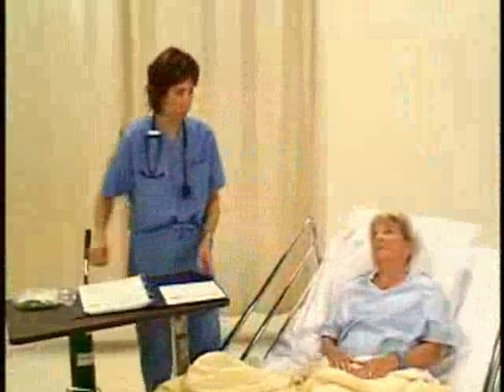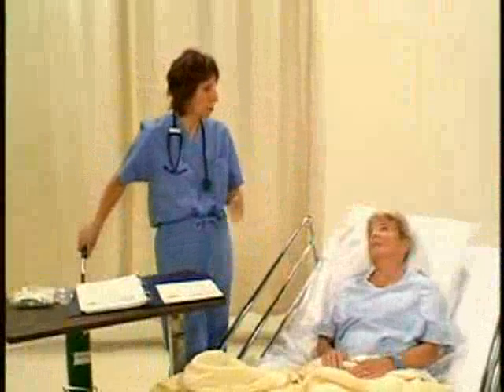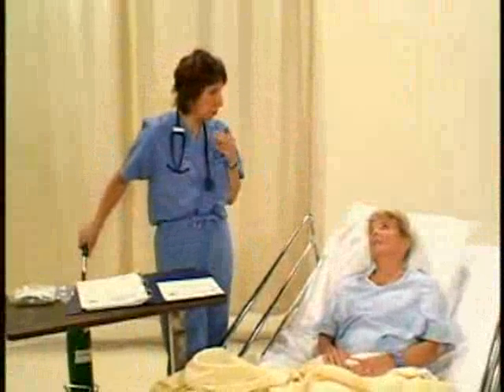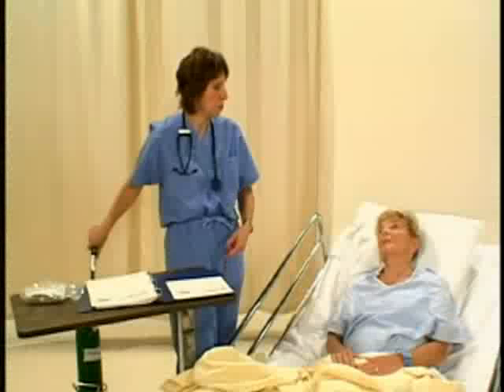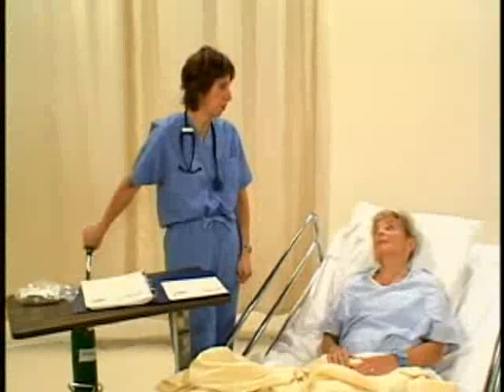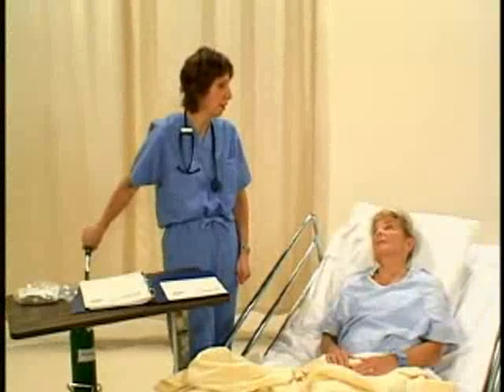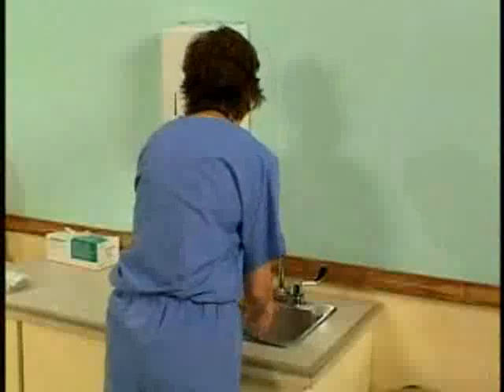Check the physician's order and explain the procedure and hazards of oxygenation via nasal cannula to the client. Explain to clients who smoke that no smoking is allowed while oxygen is in use, as it is highly combustible.